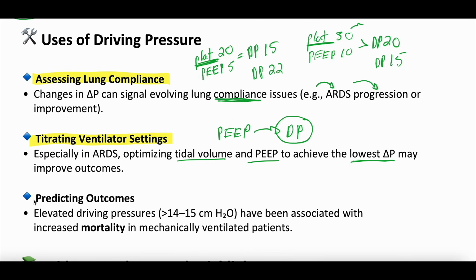And then predicting outcomes, we don't use this as much, at least personally, but elevated driving pressures are associated with increased mortality in mechanically ventilated patients.